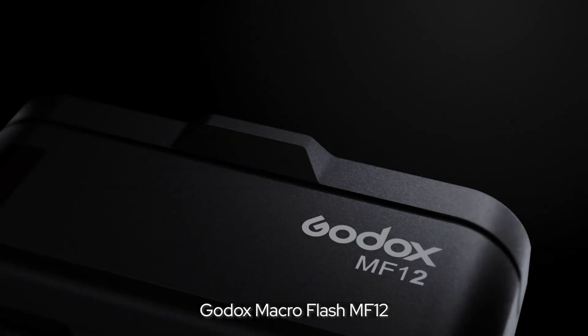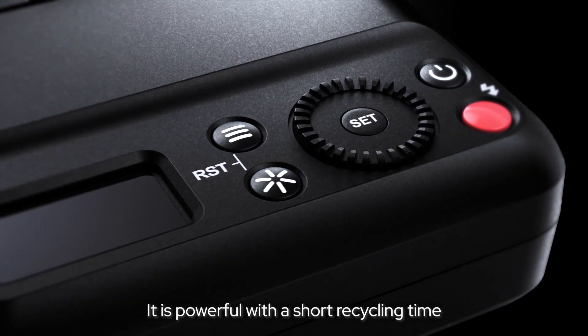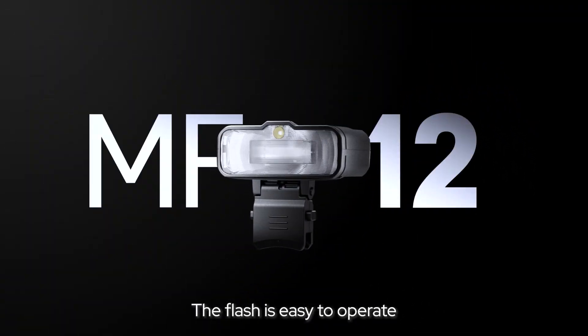The Godox Macro Flash MF12 supports TTL mode. It is powerful with a short recycling time, and the flash is easier to operate.